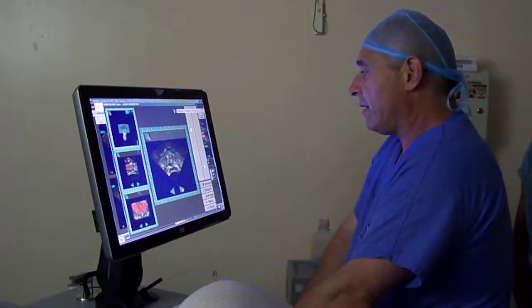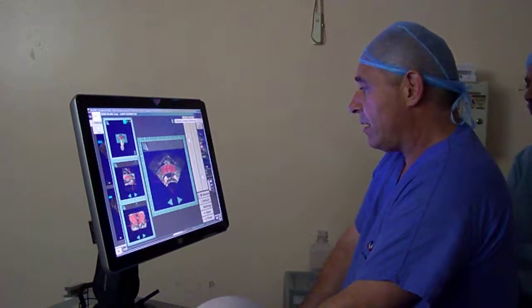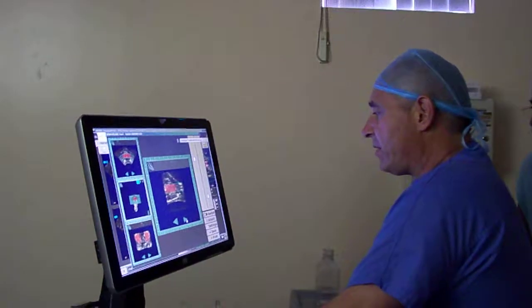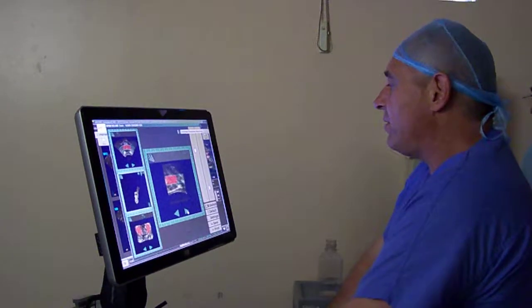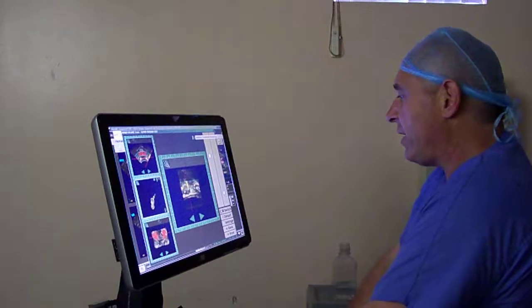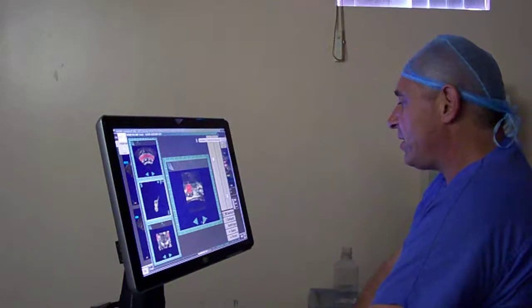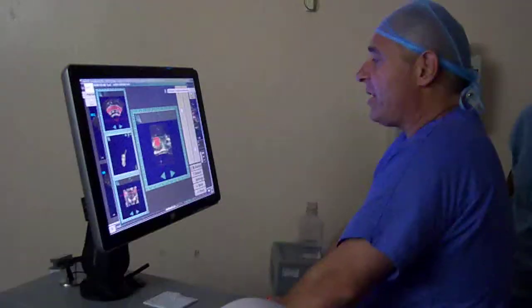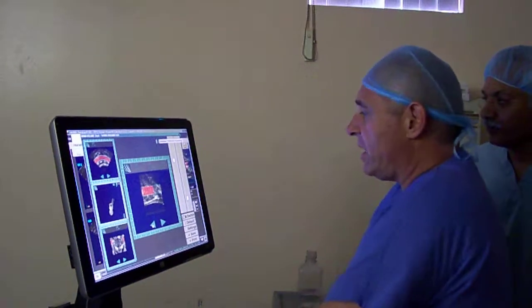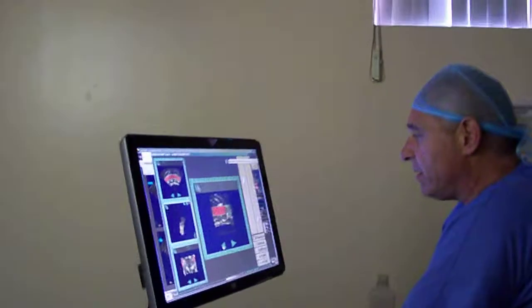Tighten that up a little bit. We're going to see that sagittal plane. So now finally we want to do the sagittal plane image. And I see way out at the side, I see a little bit of tissue out there, right? So I can put energy to it. You've got to plan this using all 3 dimensions. You can see that confining the prostate, we've got energy targeted very precisely to the prostate. But it does go outside the prostate.